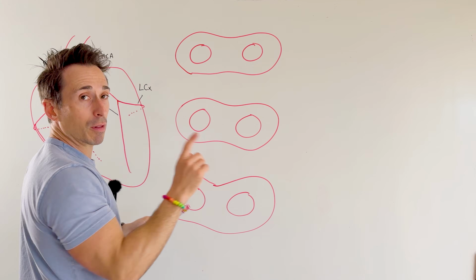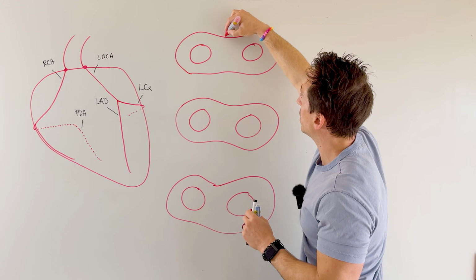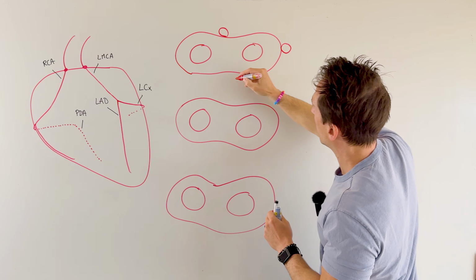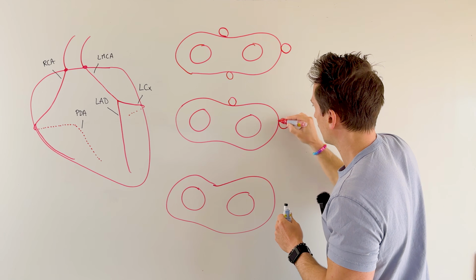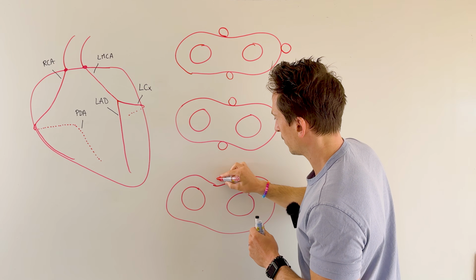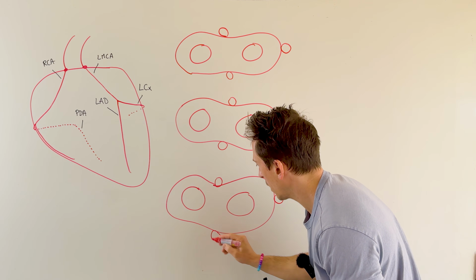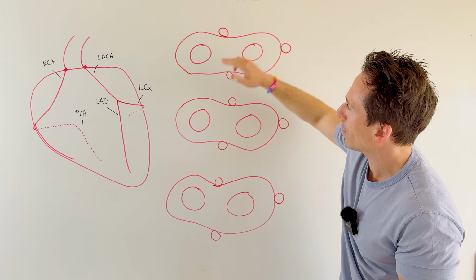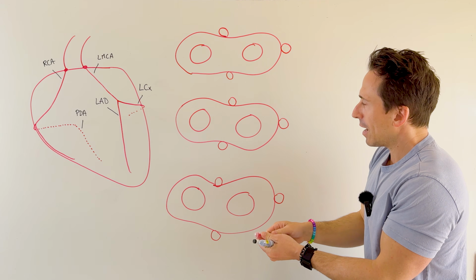And we're going to look at it in 3 different ways. So firstly, let's draw up some of these coronary arteries. So draw up an artery there, an artery there, and an artery there. And let's do that for all 3, okay? All right, now what I want to do is talk about, of these 3 coronary arteries, what are they associated with here?